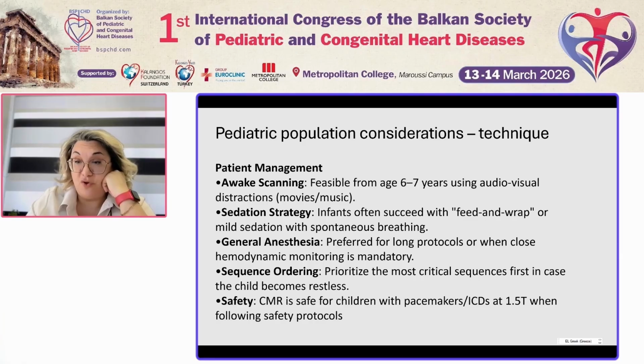For longer, more complex protocols or when close hemodynamic monitoring is required, general anesthesia may be necessary. A practical consideration during pediatric scanning is sequence prioritization. So the most clinically important sequences should be acquired first in case the examination needs to be stopped.